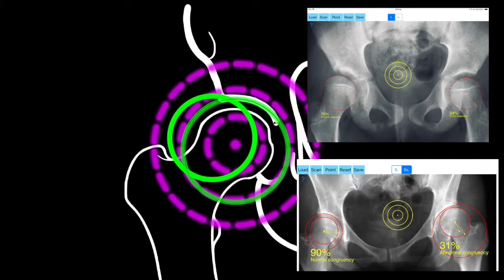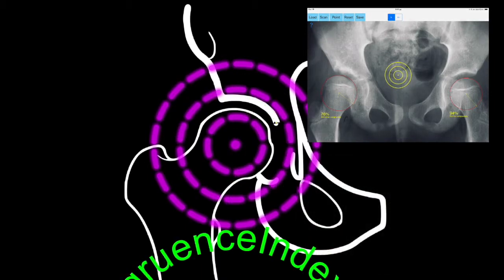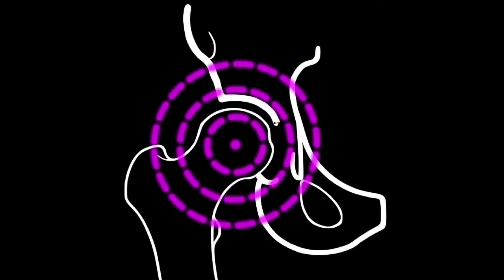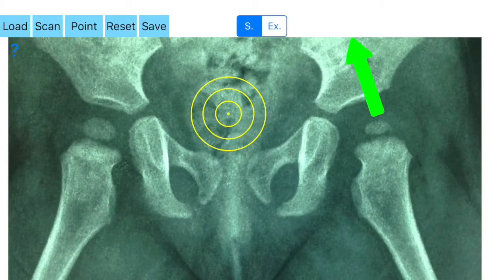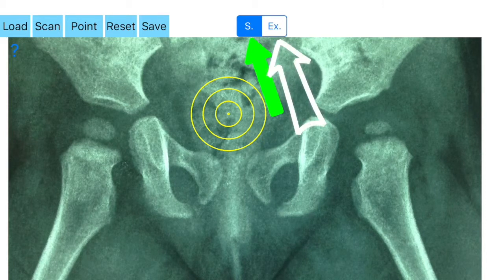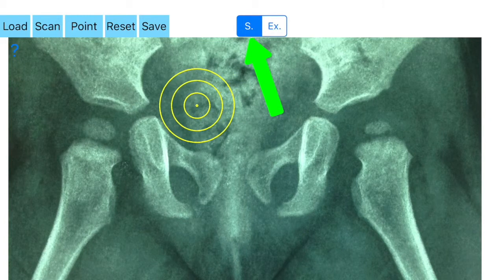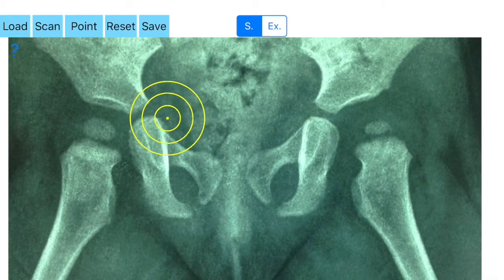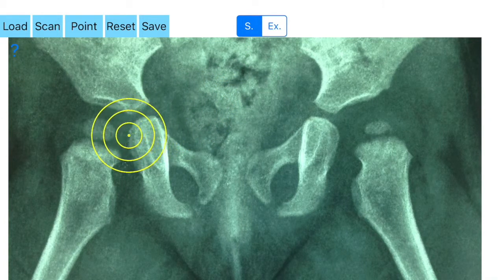The app offers a very convenient way to measure congruence. The first thing is to load one image. The app offers two ways to measure: the simple method, button S, or the extended method, button X. By default, the S button is highlighted, which means the simple method is chosen. The transparent circular template — the Moses template — consisting of several concentric circles then appears.